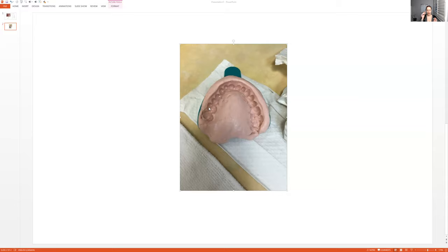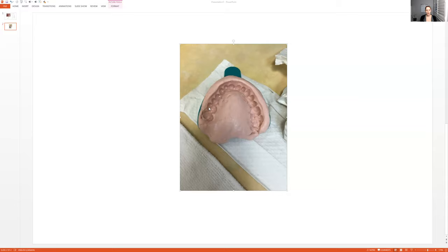So then you would put the tray obviously aside in that damp paper towel and then tell them, okay, how was that? Any questions? They'll probably be looking at you like, oh my God, that was horrible. Let them know the bottom's so much easier because you have a tongue. So less material. You don't take impressions of the tongue, right?